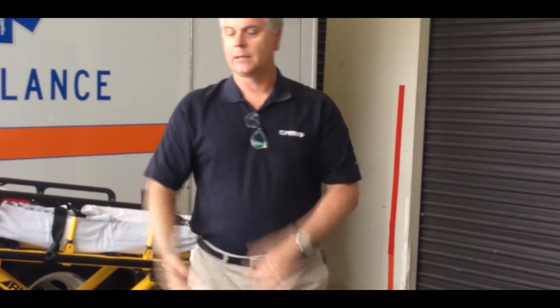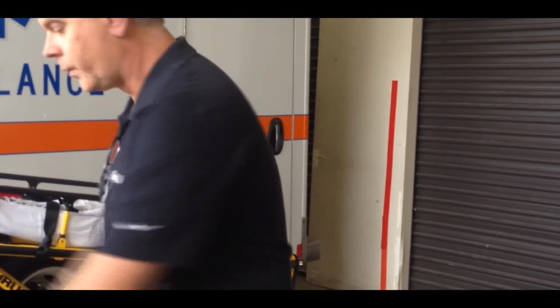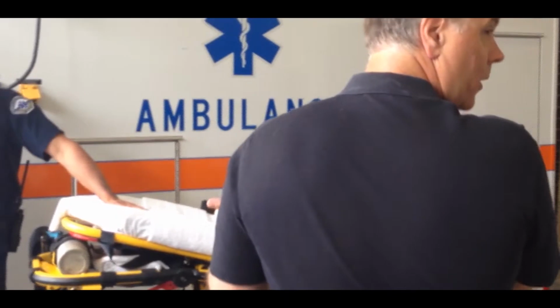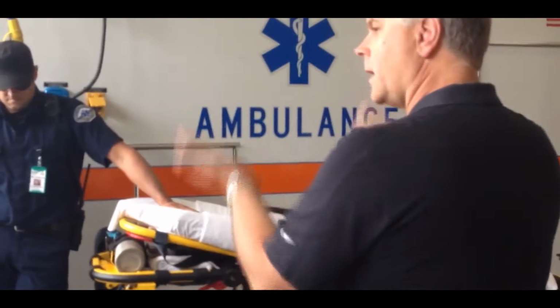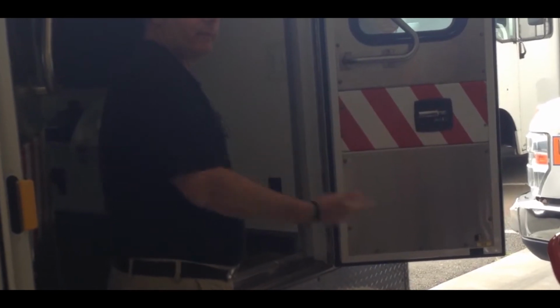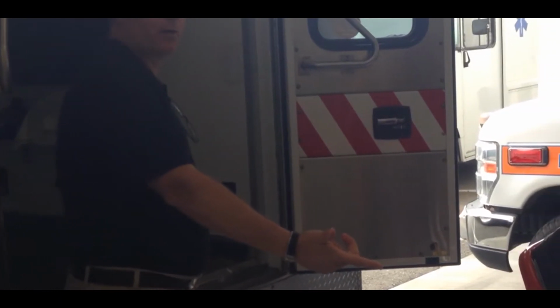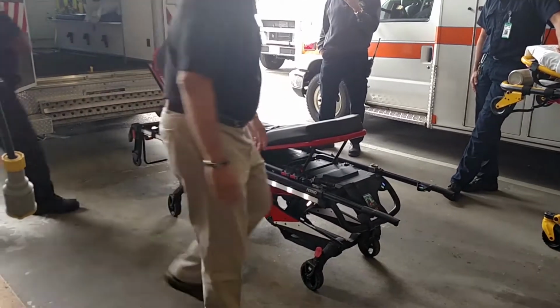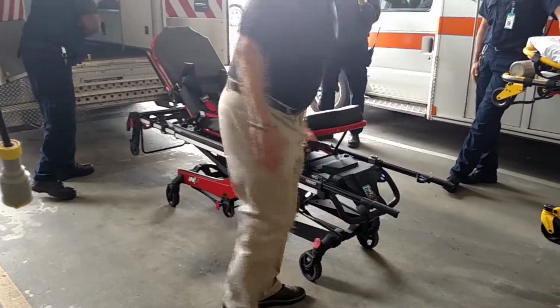And with independent leg, if we had somebody on here, one guy could squeeze this while the two of us could essentially seesaw. You're not having to hold the whole weight of it, okay? Seesaw it up to the point where once we get the load wheels to the height of the floor, now it's the floor and the ground doing all the work. You don't have to hold it anymore. Then you can just fold your legs up and finish the call. Does that make sense? That's worst case scenario.